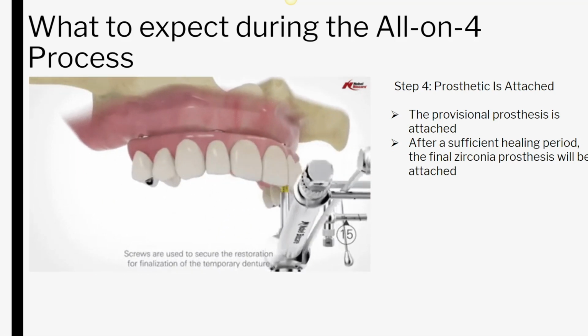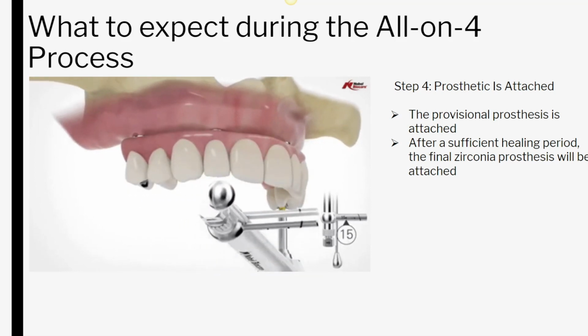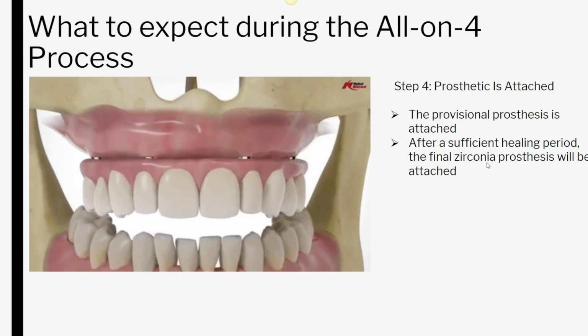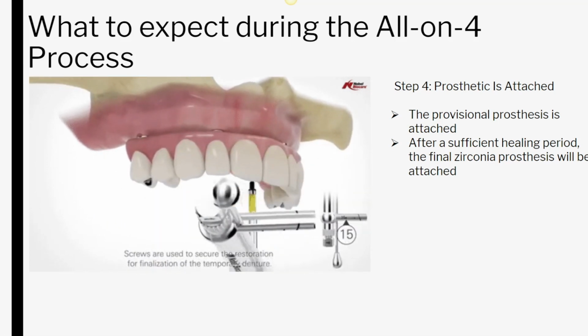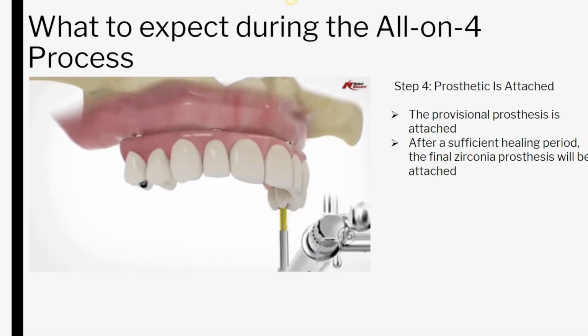So after you've healed for about 4 to 5 months, what we will then do is begin the process of converting you to your final zirconia prosthesis. Again, the final zirconia prosthesis is what we were talking about earlier. It's the prosthesis that is going to be beautiful, not prone to breaking, and that prosthesis we will place at about the 4 to 5 month mark.